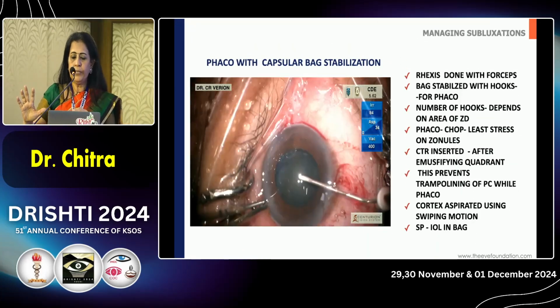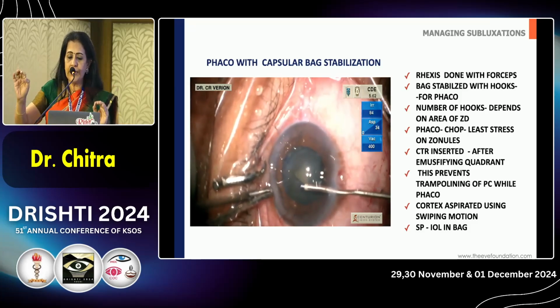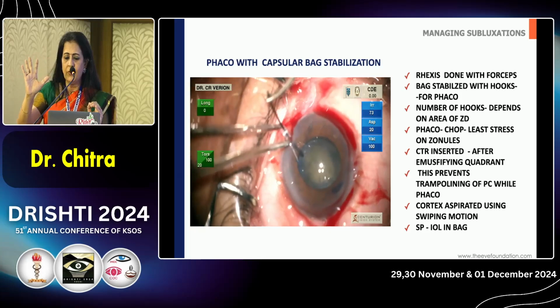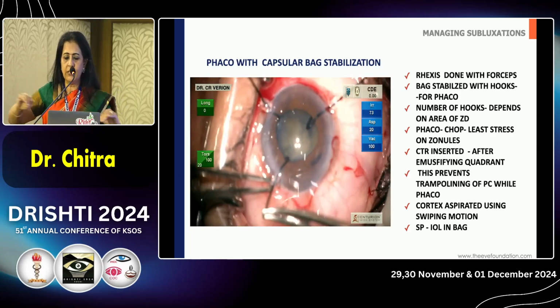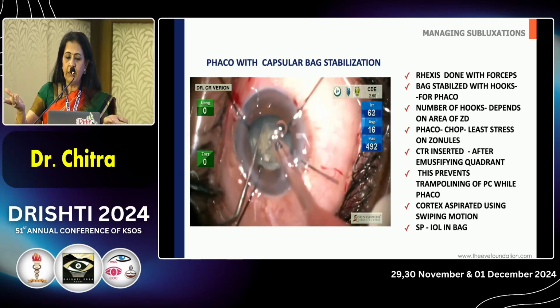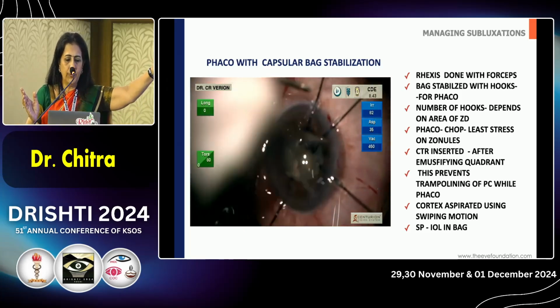Now, in this particular case, the phacodonesis was not seen on slit lamp, but while I started, I felt that the tactile stimulus was not there. It looked as if there was subluxation, no taking chances, place capsular hooks. And then I find I can easily rotate, I'm able to separate, I'm able to chop. But look carefully, that small area of zonular weakness superiorly.